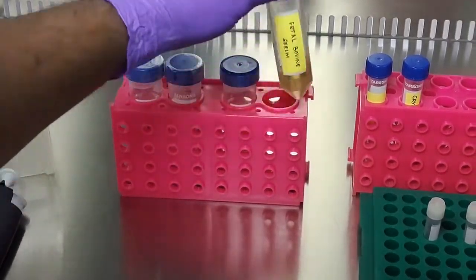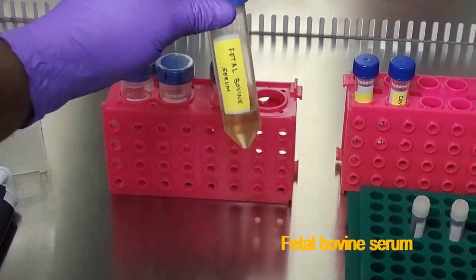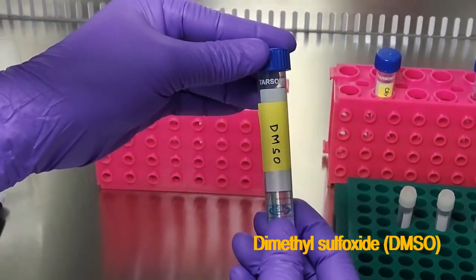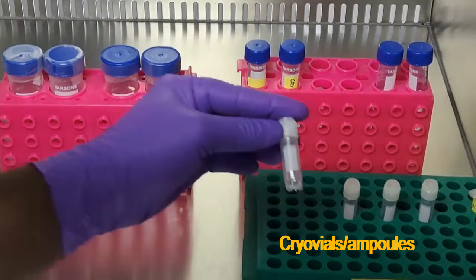We also need fetal bovine serum, dimethyl sulfoxide (DMSO), and cryovials or ampules.